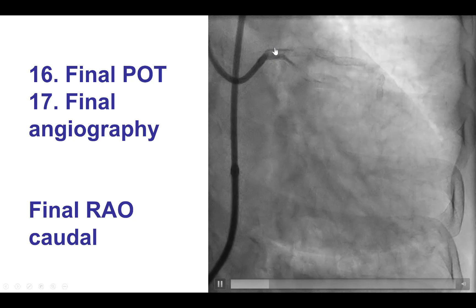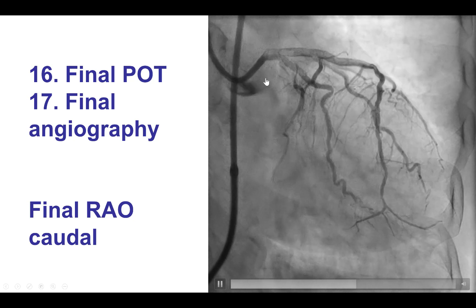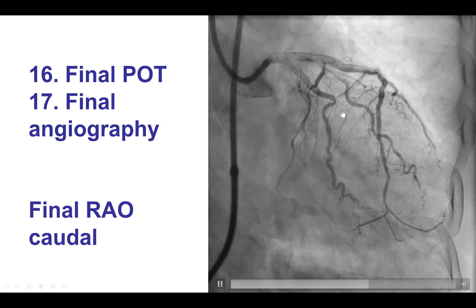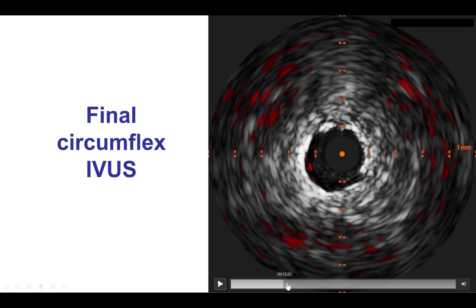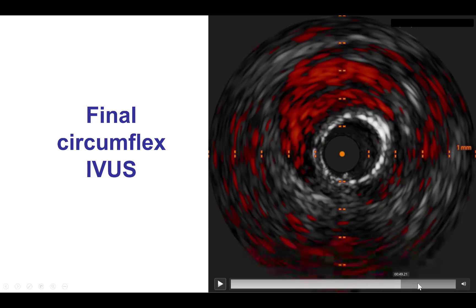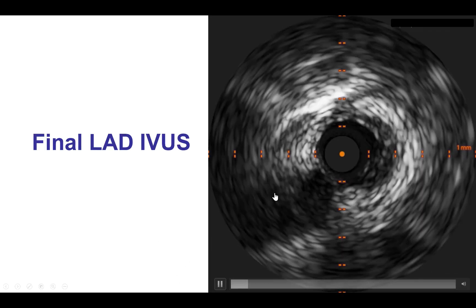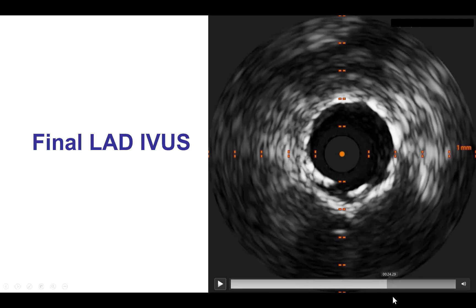We then did another proximal optimization technique to ensure the proximal vessel was in excellent quality, followed by a final angiogram and intravascular imaging to confirm a nice result. This is the final IVUS of the circumflex, showing a good result with good stent expansion all the way into the left main. This is the final result into the LAD — also a good result with good stent expansion and stent strut apposition coming all the way back to the left main.